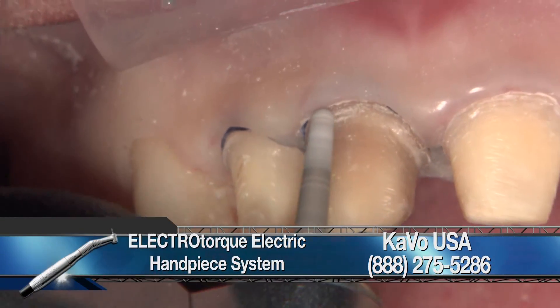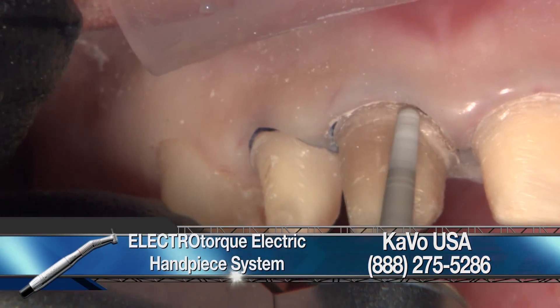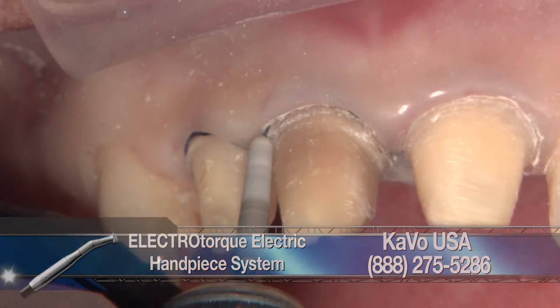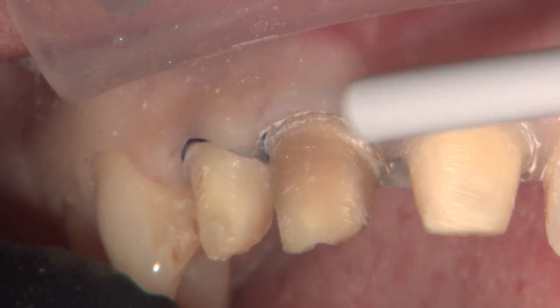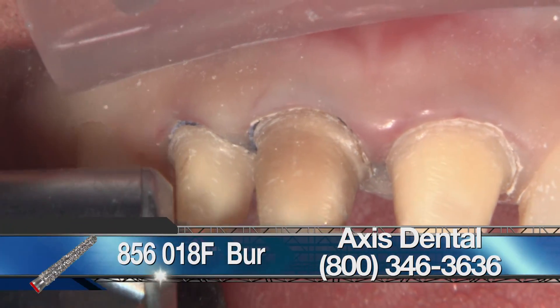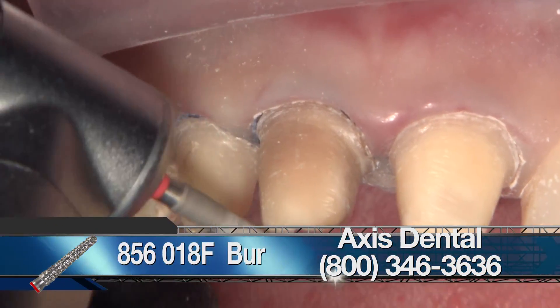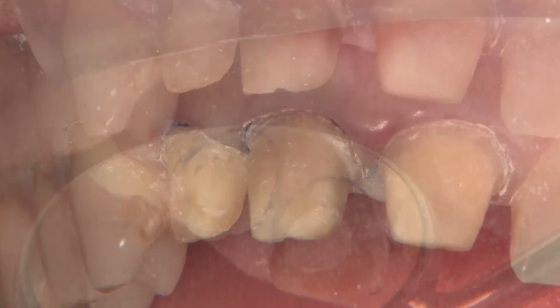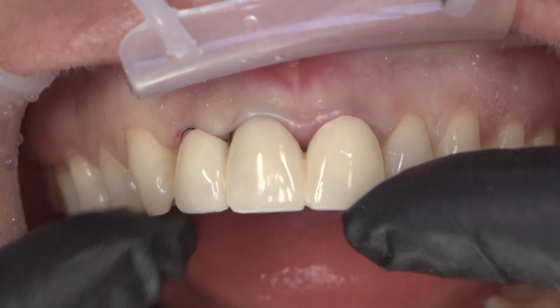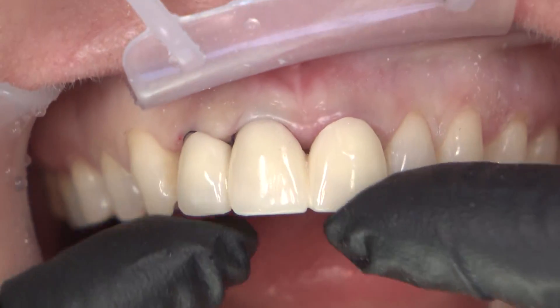I'm going to turn the handpiece down to 2000 RPMs and smooth off the margins with a fine bur — the 856-018F, where F means fine grit, indicated by the red stripe. You can see there was a recent endo done, with an endo access on the lingual of that tooth, and we're going to get to that in a little bit.